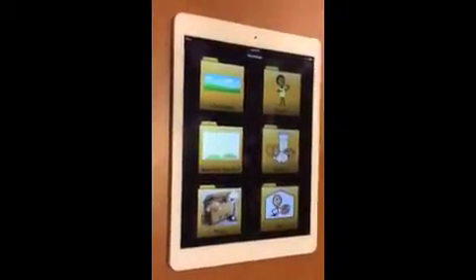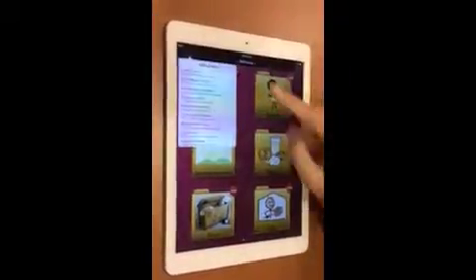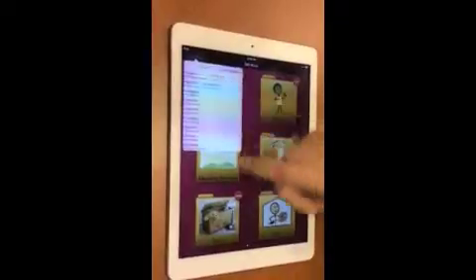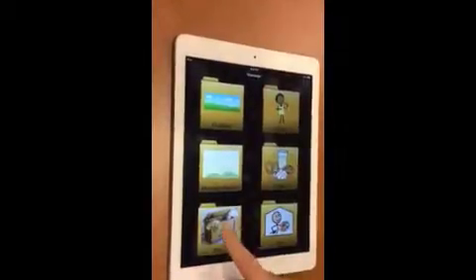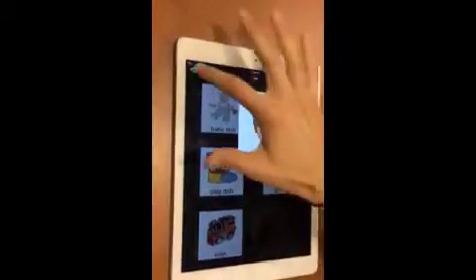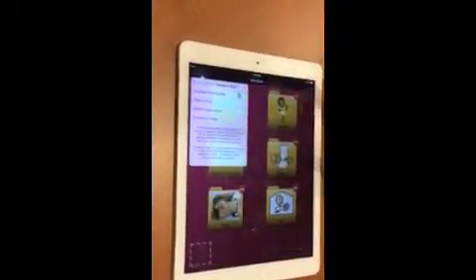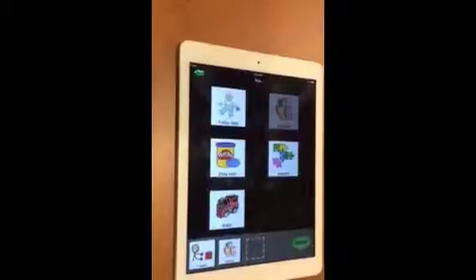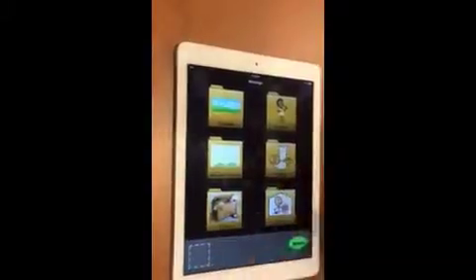Here's our app, So Much to Say. On the home page, we have set it up to be categories and out of 6 choices, but you can change it to 1 through 12 cards, or you can change it to card-based instead of category. So if I wanted to pick a toy, I could tell you blocks. But if I wanted to say the full sentence, I could go into sentence strip, change it, and say, I want blocks. And then swipe it to clear.